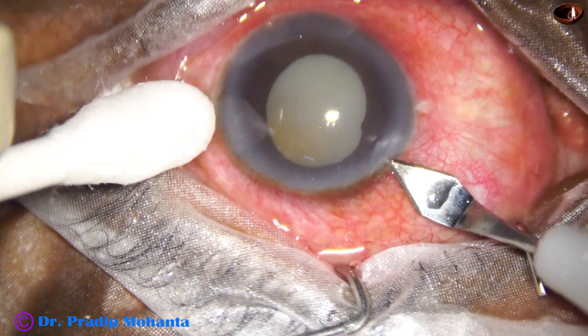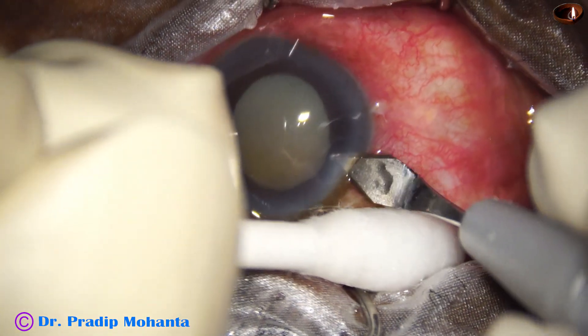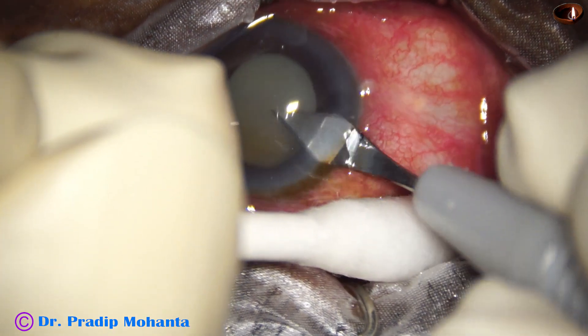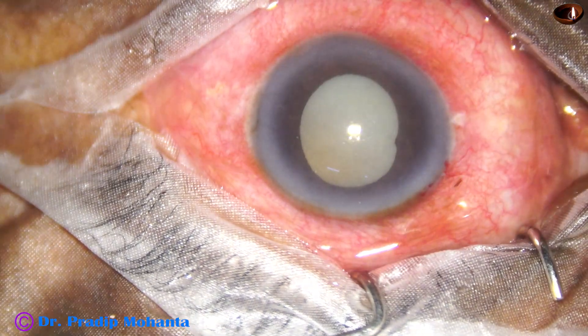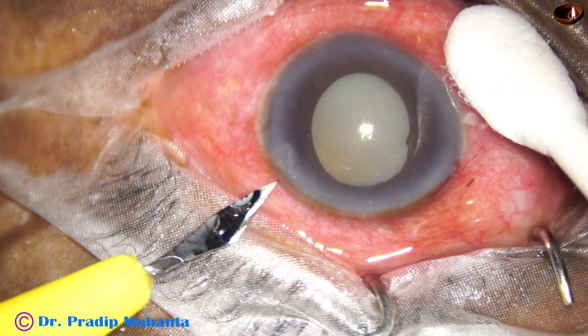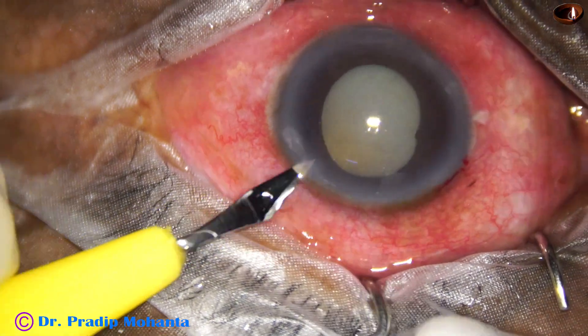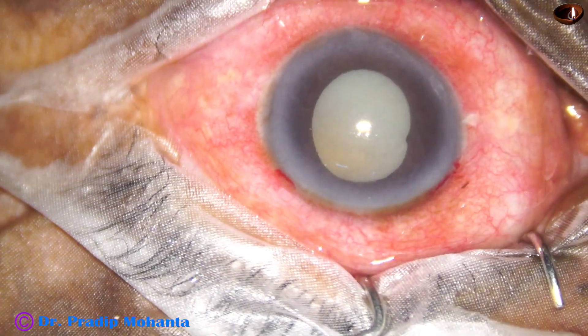This is the main incision with a 2.8 millimeter steel keratome at around 11 o'clock. And now a side port is being made on the left side of the main incision, about 3 clock hours away.